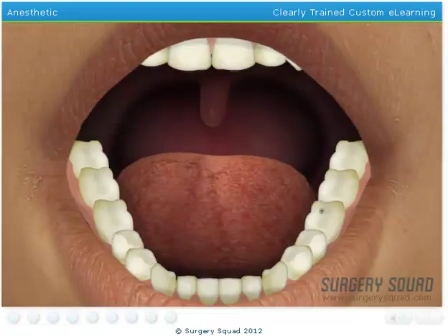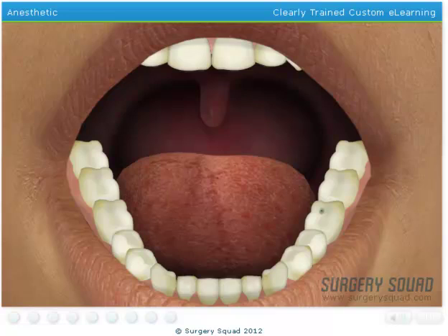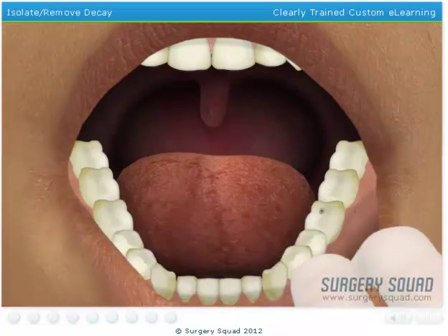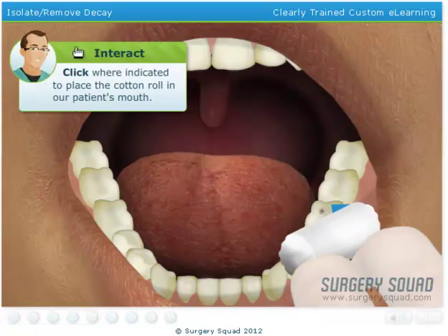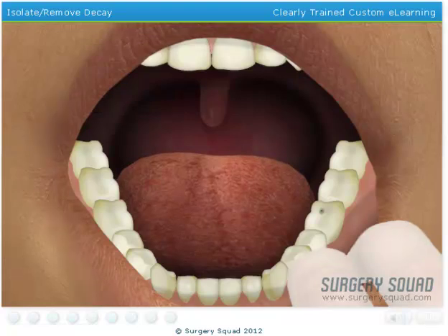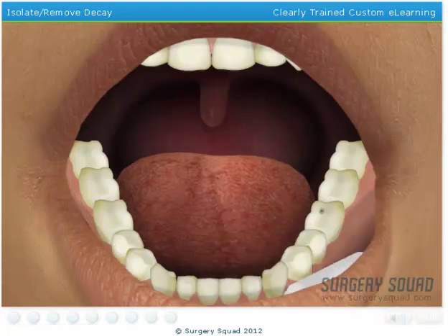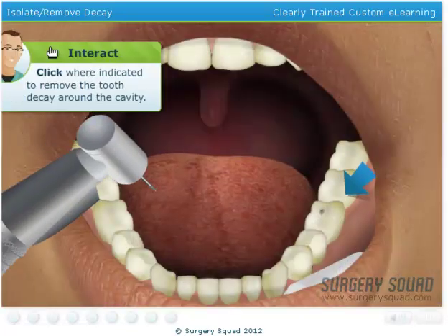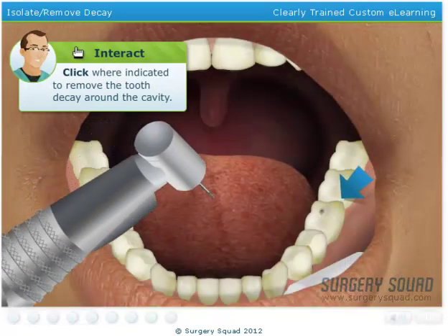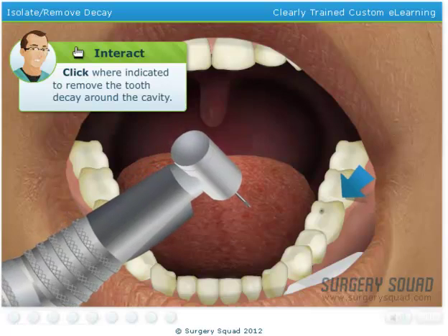Now that our patient's mouth is numb, we can move on to removing the decay. To begin, we'll need to isolate the tooth using a cotton roll — this will give us some space to work. Dentists typically remove tooth decay with a burr inserted into a handpiece, which is what most people refer to as the drill. Prepare the area by using the burr to carefully remove all of the decay from our patient's tooth.